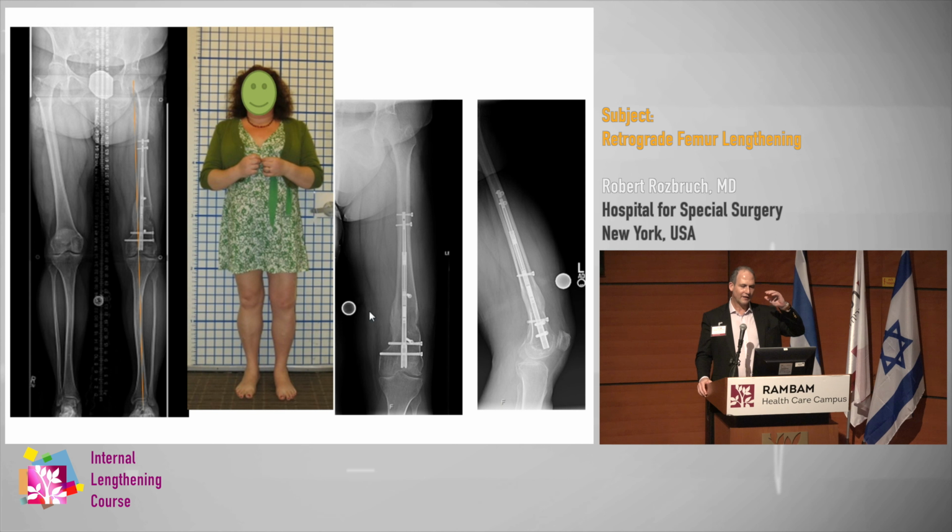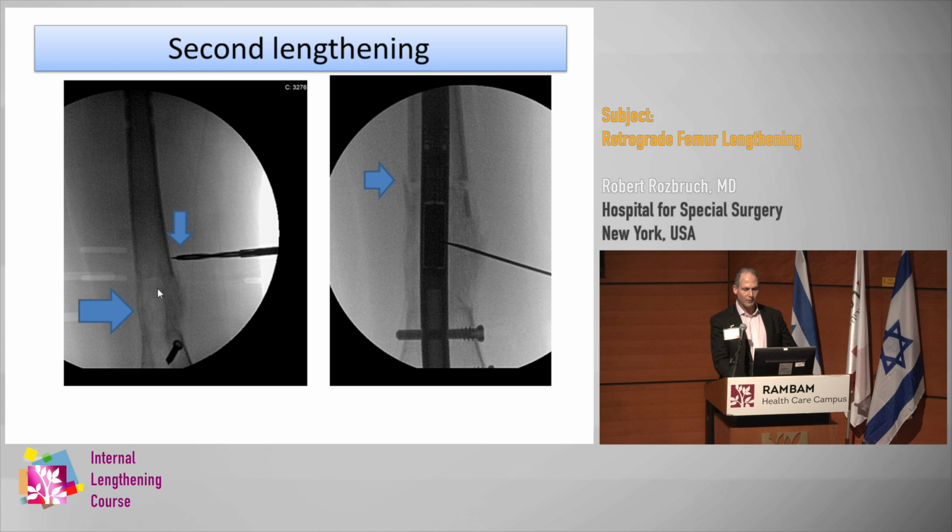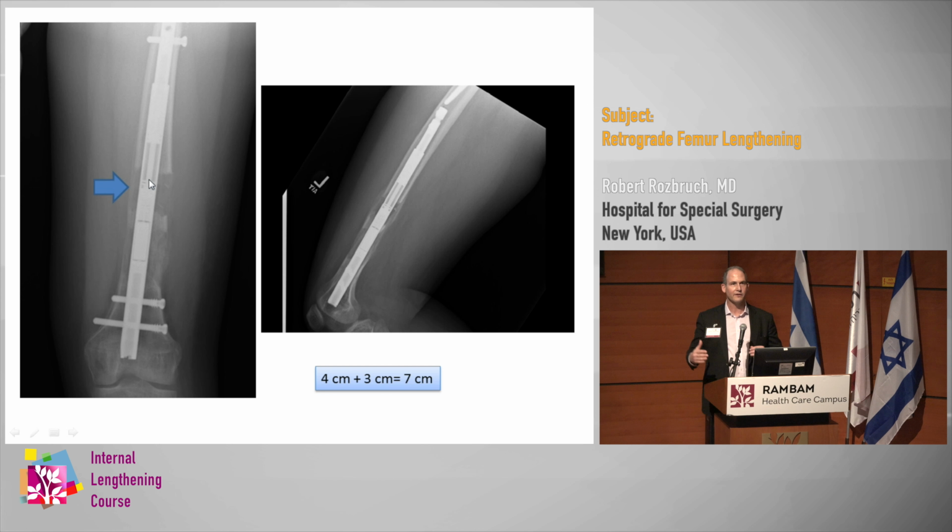So stage 1 is over there, you can see, and then once we got healing, the first lengthening was 4 centimeters. Then I took her back to the operating room. I left the blocking screw in place. I did a second osteotomy just adjacent to the first regenerate, and then we went in and put in a second nail, right? This is my second osteotomy now, and you can see the lengthening, so it's stacked lengthenings, one lengthening over the other, and that allowed me to get 4 plus 3 equals 7 centimeters of length.